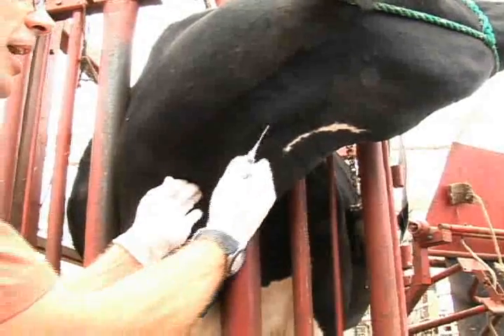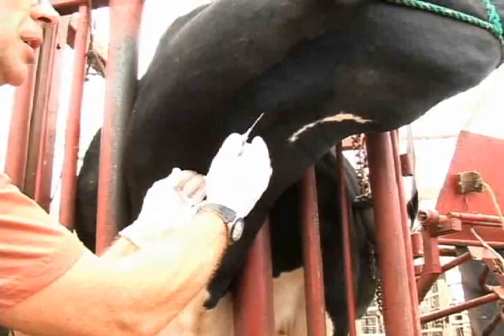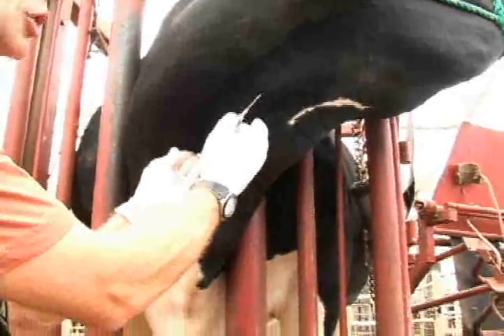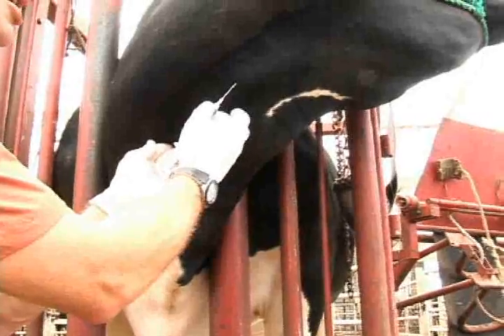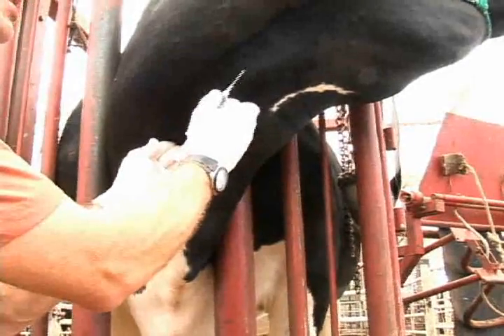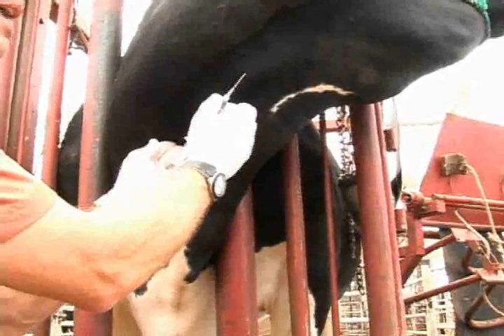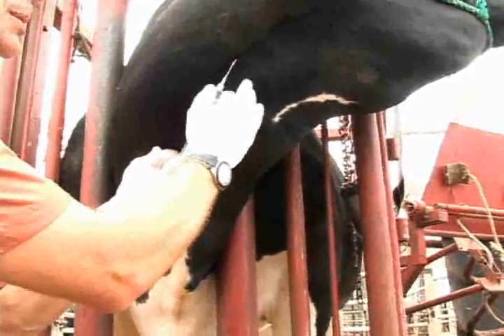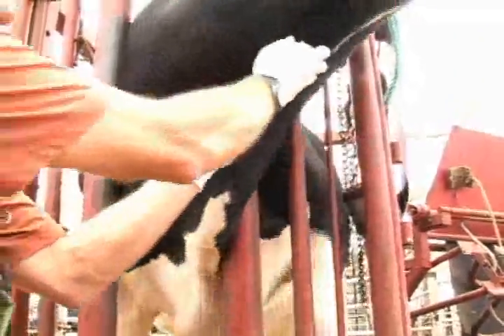Once you identify that, you can steady your hand onto the animal's neck. And when you're ready to penetrate through the skin with the needle, you must choose your spot and you must actually go pretty quickly. You cannot place the needle onto the skin surface of the animal because she will negatively react to that. So once you've identified your spot, steadied your needle and your hand, then place the needle into the jugular vein.